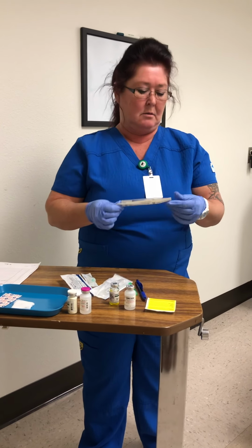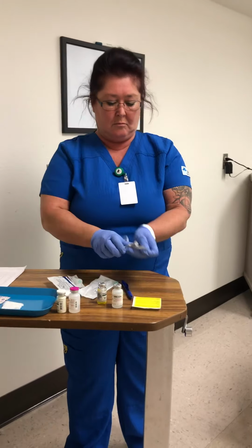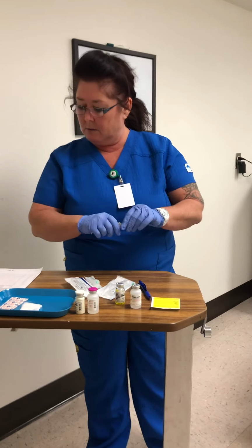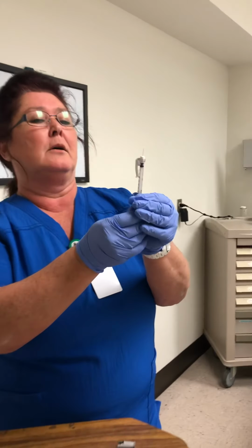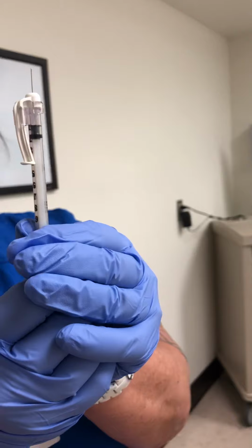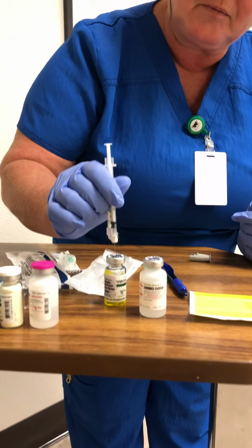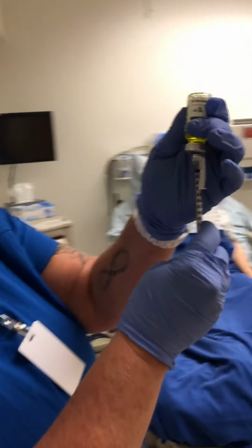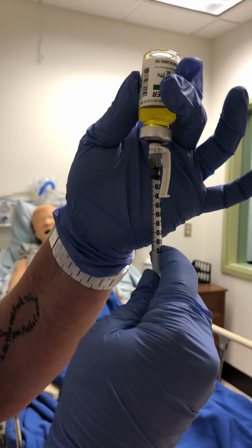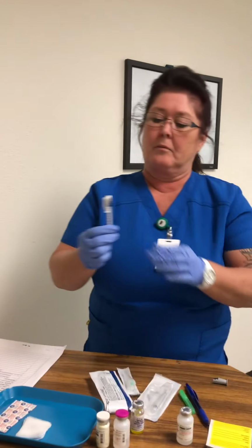So now I'm going to take my TB needle and we are going to draw 0.1 mils. So first thing I'm going to do is draw back 0.1. And I'm going to insert, pushing in the air, tipping up, and drawing 0.1 mil. I will tap out any air bubbles.